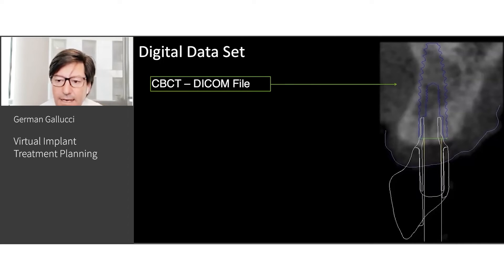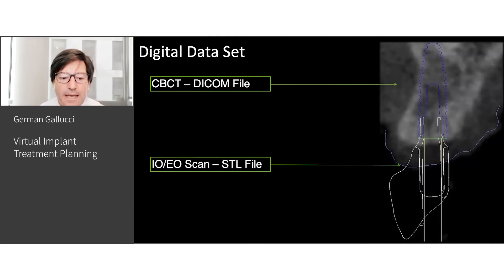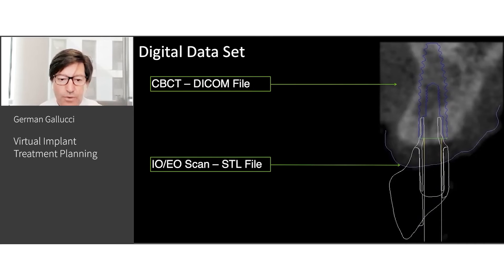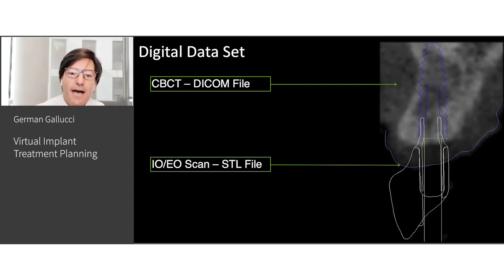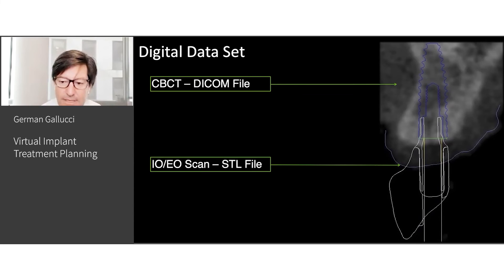We start by collecting a series of files. In this case you see a CBCT that produces a DICOM file, and an intraoral scanner that produces an STL file. These two files are then matched or superimposed so that you can reproduce the surface portion of the maxillary or mandibular arches with the three-dimensional concept given by the CBCT.